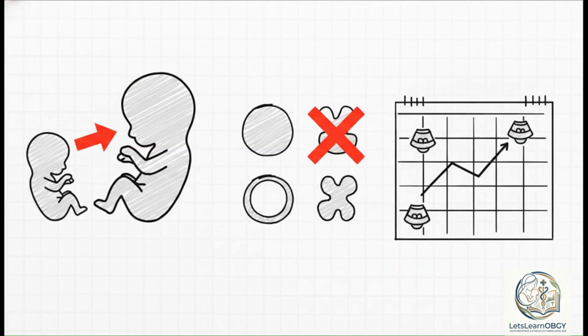So what's the game plan when your data totally conflicts? Here are your hard and fast clinical rules. If you're dating twins and their measurements conflict, the general consensus is to base the EDD on the larger twin. If you have a single biometric marker totally throwing off your averages, like an abdominal circumference distorted by gastroschisis, for example, you simply omit that anomalous marker from the overall calculation. For those suboptimally dated pregnancies we just talked about, the protocol is to rely on serial scans spaced 3 to 4 weeks apart to assess the interval growth trajectory. It's all about the trend.